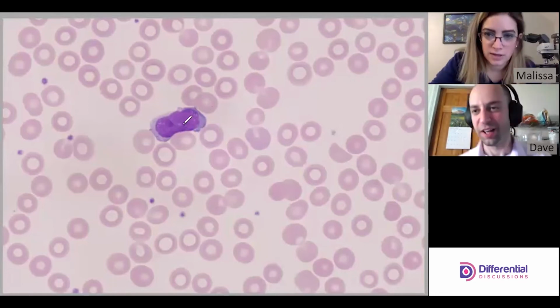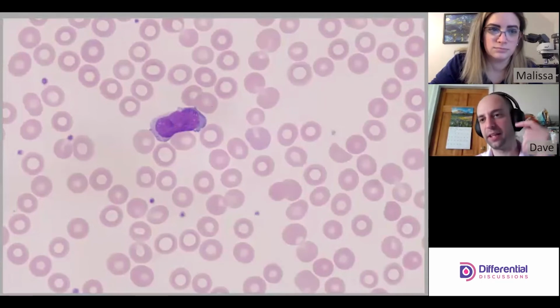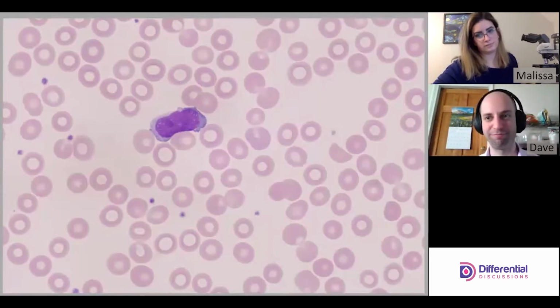But I also think there's a nucleoli. I think we started a bit there. Oh, did we? I'm sorry. No, it's fine. I think we're all caught up now. There's a nucleoli here. But this has some cool features to it. The thing I think that pushed me away from mono once I reflected on it was the differential in color. The fact that it's deeper blue there, lighter blue on the left. Monos really don't do that very often.